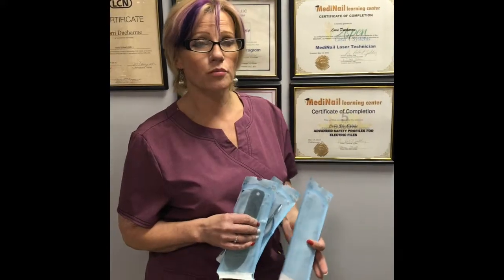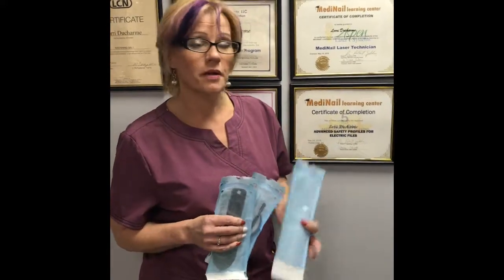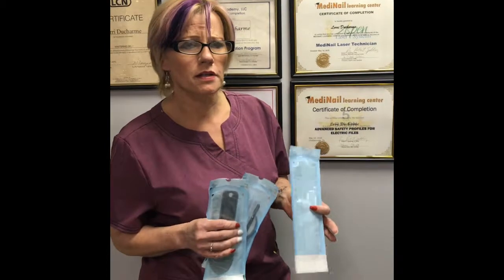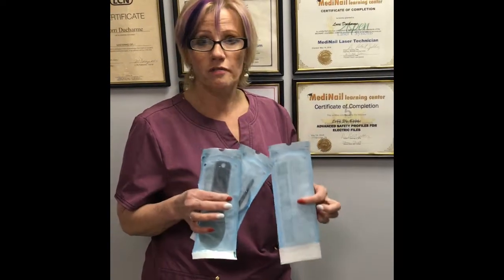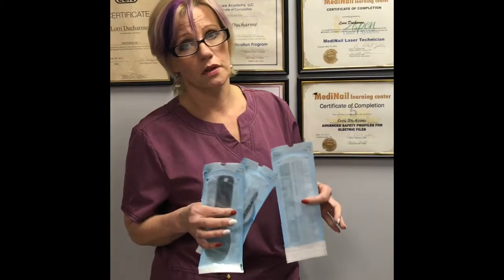Hey everybody, Lori here from Prestige Salon. I'm here with a little public service announcement about a subject that's really concerning me, because I think a lot of people are being misinformed or don't understand the importance of learning about autoclave bags and what an autoclave really is.